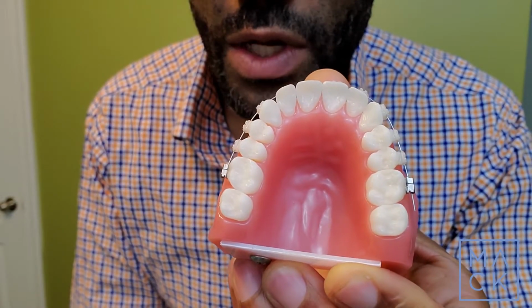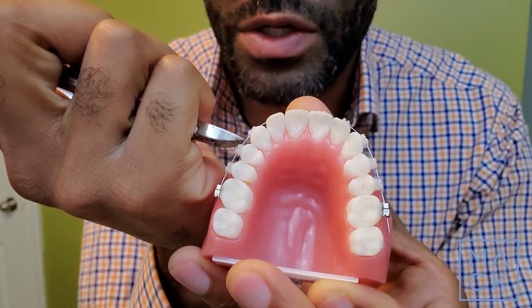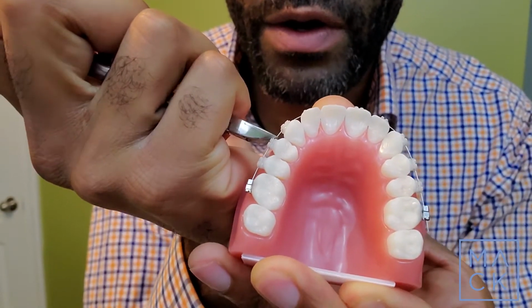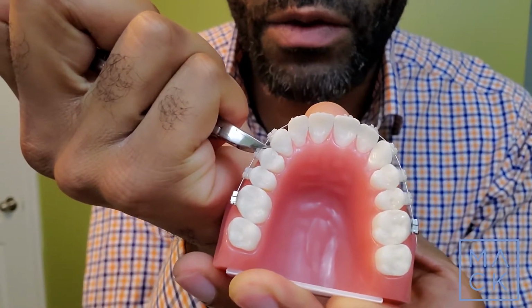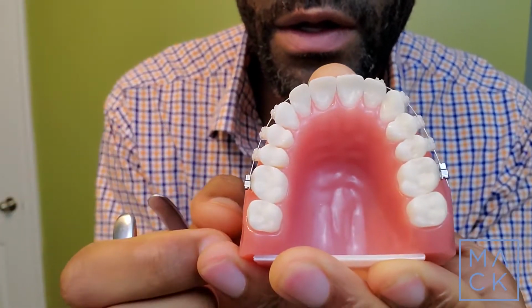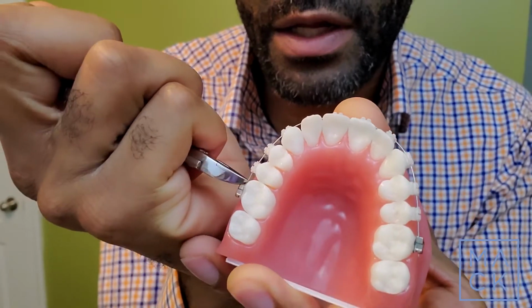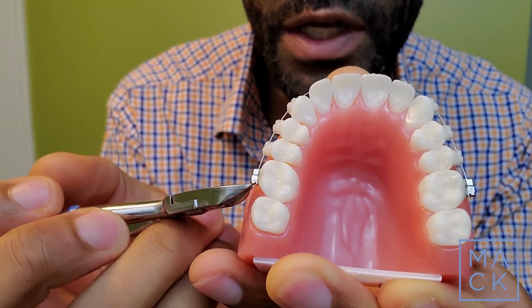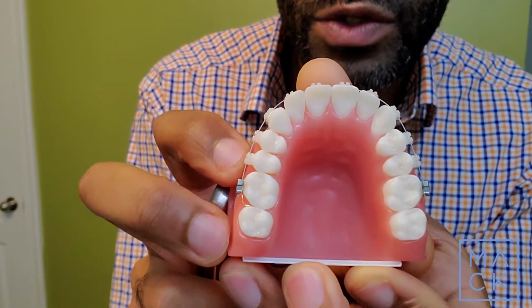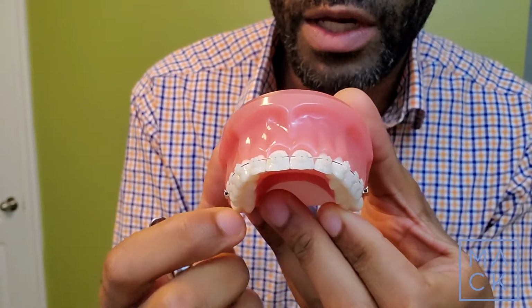The easiest way to deal with that is to simply take some kind of instrument, like a tweezer, and slide the wire over. When you slide the wire over, you will have more even amounts of wire and it will be less irritating. Very little sticking out on this side, none sticking out on this side. That's a really simple solution and it works great, especially when you have very thin wires and when you're at the beginning of your treatment.